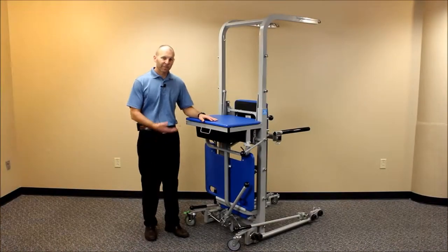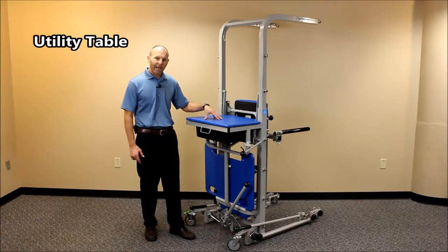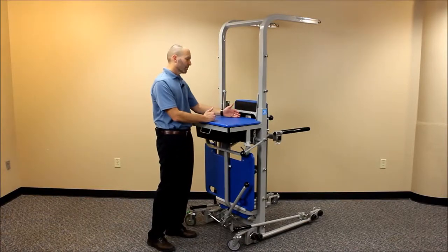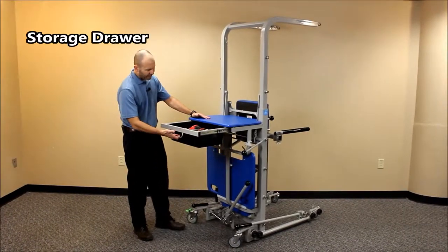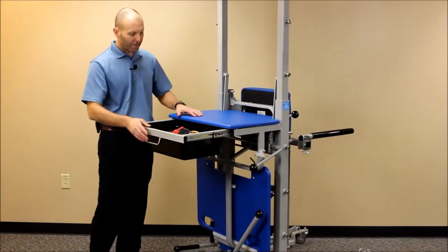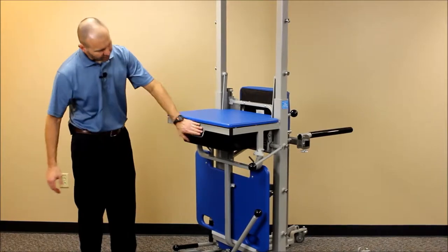I'd like to talk about some of the major features of the rehab station. First of all, you'll notice there's a table in the back — it's a great place for documentation, or for patient-facing activities. We've also got a self-closing drawer here that is great for storing accessories or anything else you need for therapeutic purposes.